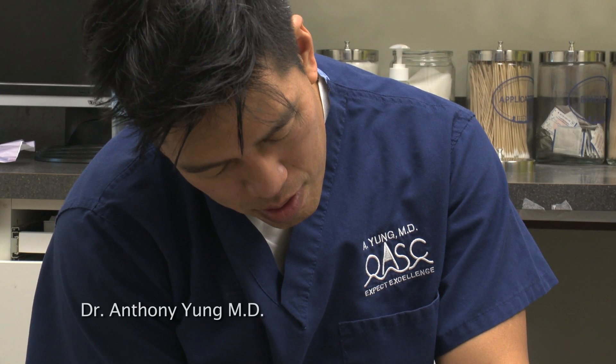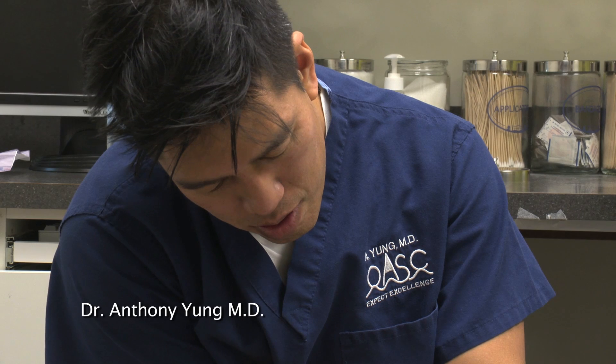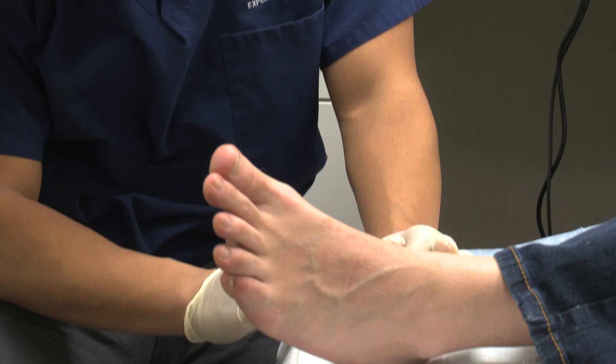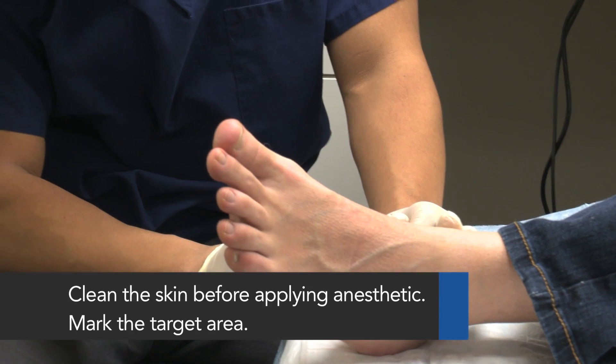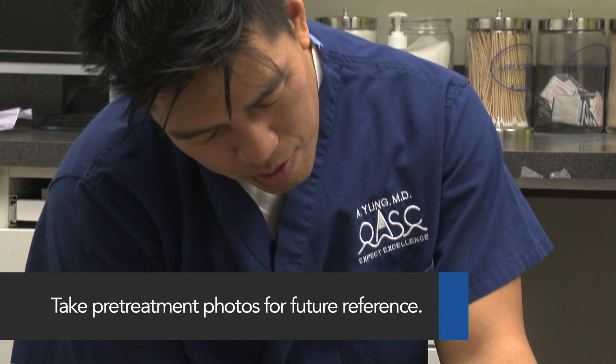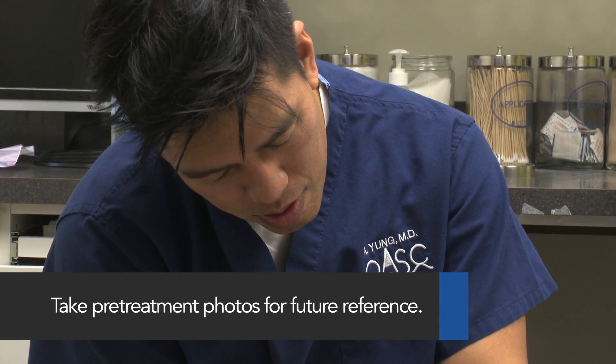It is important to conduct a simple pre-treatment examination on all patients. Obtain medical history and informed consent. Contraindications for this treatment are pregnancy and skin cancer. Before beginning the treatment, carefully clean the skin and mark the target area. It is advisable to take pre-treatment photographs for future reference.